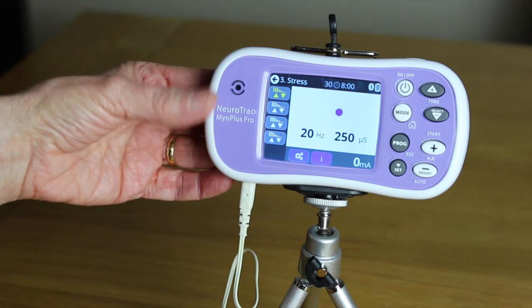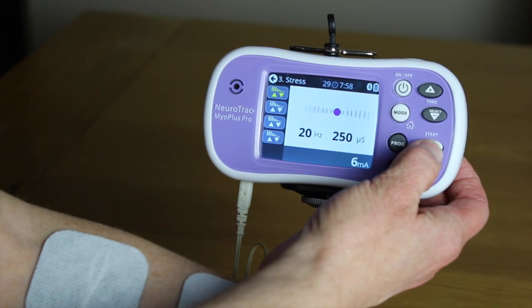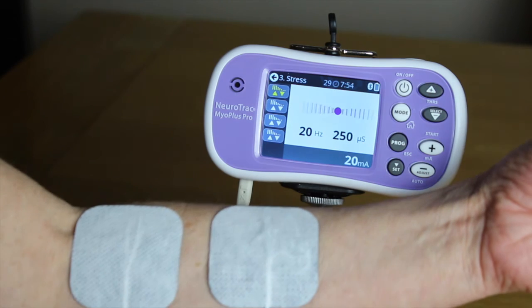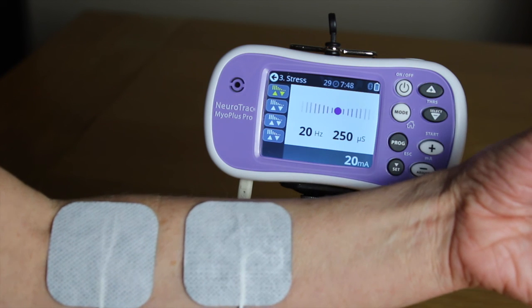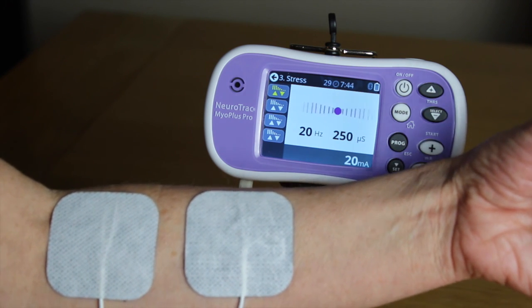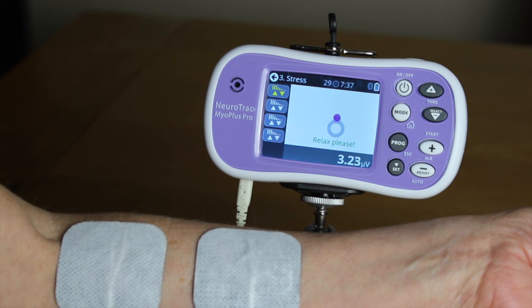Each phase can be viewed in the same way. To commence the stimulation, continue to press the start milliamp plus button and as the output increases the muscle will contract. During the rest phase, the screen prompt gives the instruction to relax as well as a background reading of any muscle activity. The stress program will run continuously until all four phases are completed.